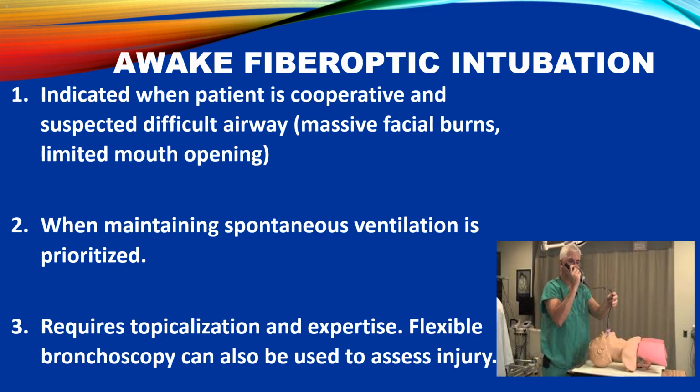2. Requirements. Topicalization. Requires topical anesthesia to numb the airway and reduce discomfort. Expertise. Requires expertise in flexible bronchoscopy and airway management.